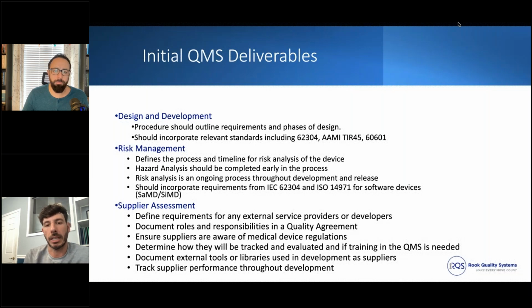Getting into the foundations of designing and validating a device. So that's the high level overview on the quality system. This can be slightly overwhelming, but it is something that you want to really make efficient, make it the right size for your company, and try to do everything you can to comply with the quality system and work in it as you're developing the device.